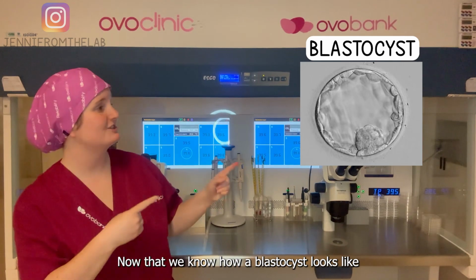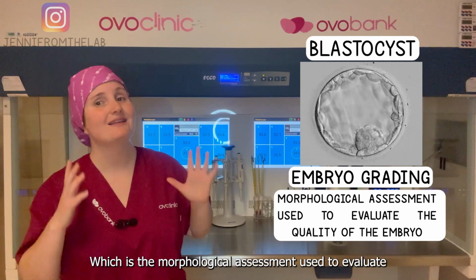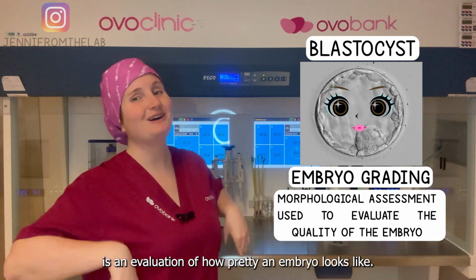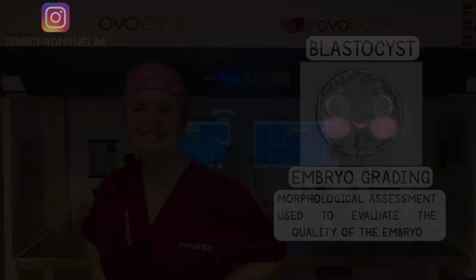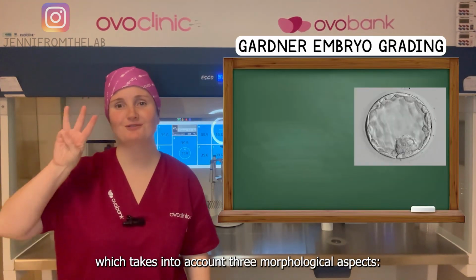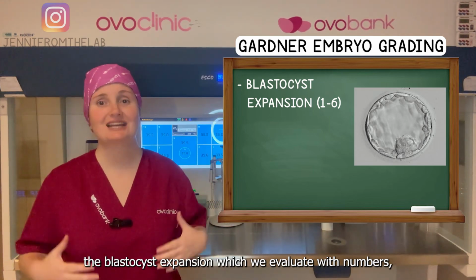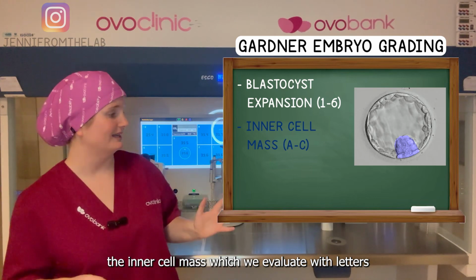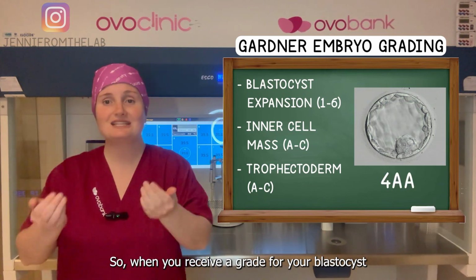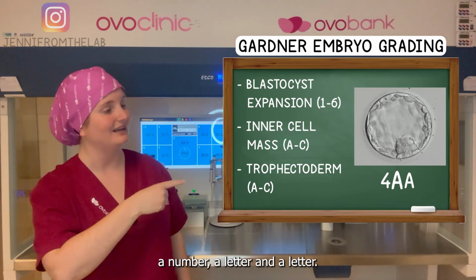Now that we know how the blastocyst looks, we can talk about embryo grading, which is the morphological assessment used to evaluate the quality of the embryo. Basically, embryo grading is an evaluation of how pretty an embryo looks. The most common embryo grading is the Gardner system, which takes into account three morphological aspects: the blastocyst expansion, which we evaluate with numbers, the inner cell mass, which we evaluate with letters, and the trophectoderm, which we also evaluate with letters. So, when you receive the grade of your blastocyst, you will notice three different elements: a number, a letter, and a letter.